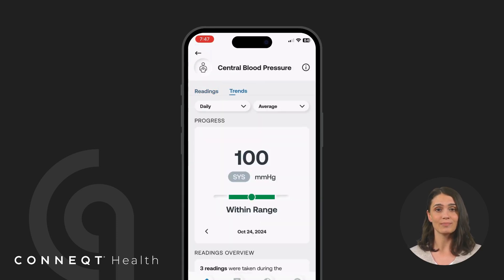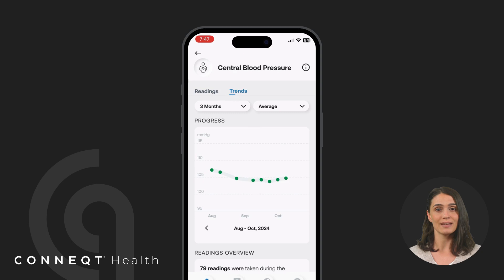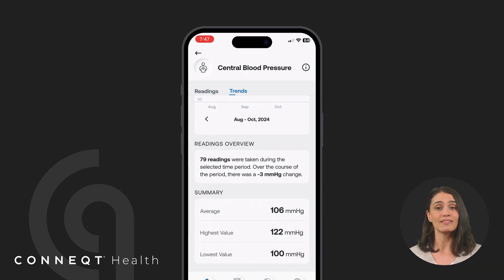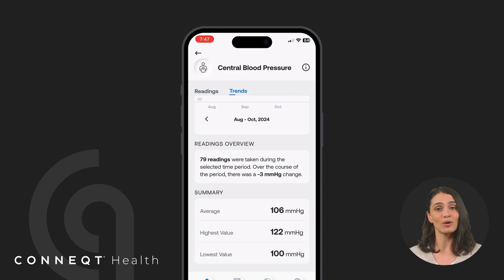To gain deeper insights into your progress, go to the Trends tab. You can see trends over different time periods, including a week, one month, three months, or a full year. Beneath the trend graph, the app will provide a summary of your progress based on the selected time period, helping you understand how your cardiovascular health is changing and improving over time.